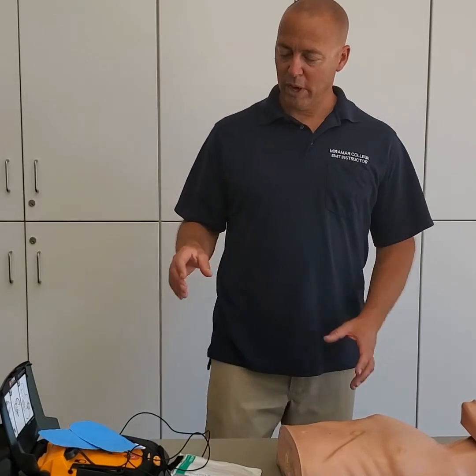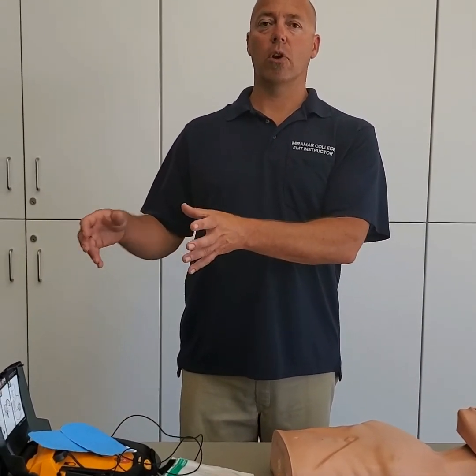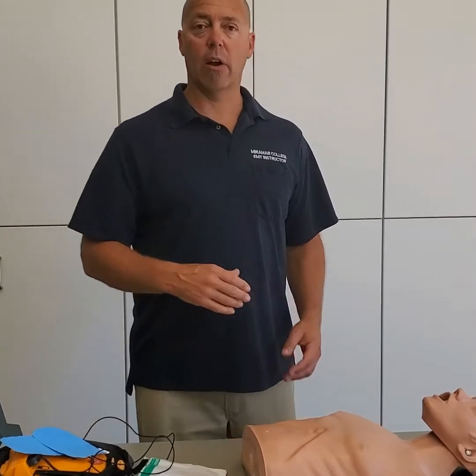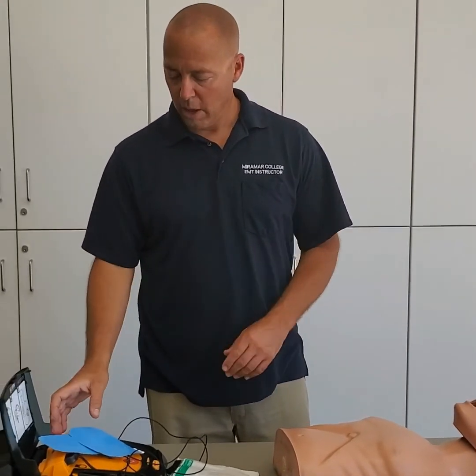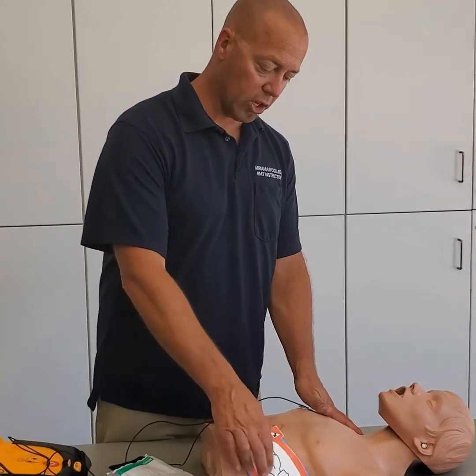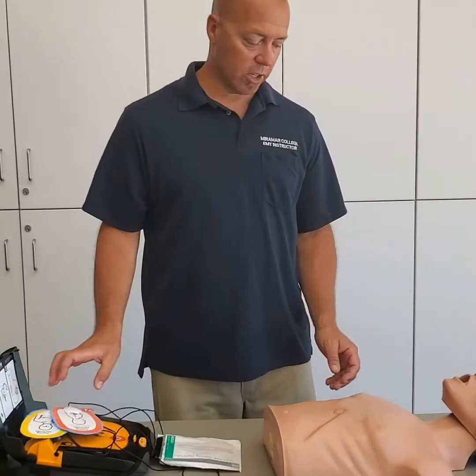So remember: our patient has to be out of any standing water, so no pools and ponds. We would get them on dry ground and dry off the chest. If they had a hairy chest, we would take our razor, scrape off that hair, then apply the pads. And again, the pad placement is the patient's right upper chest and left lateral ribs.